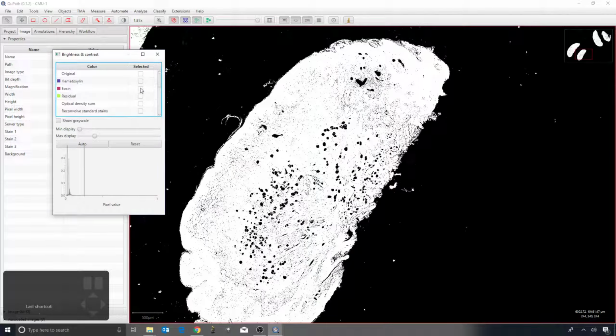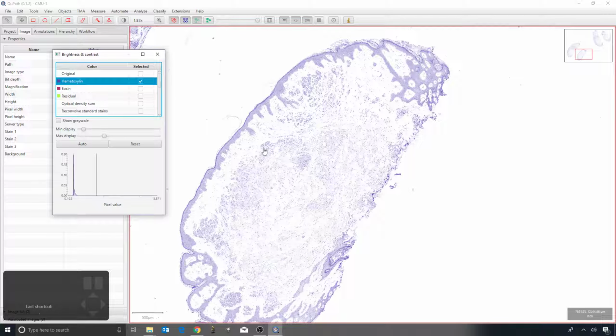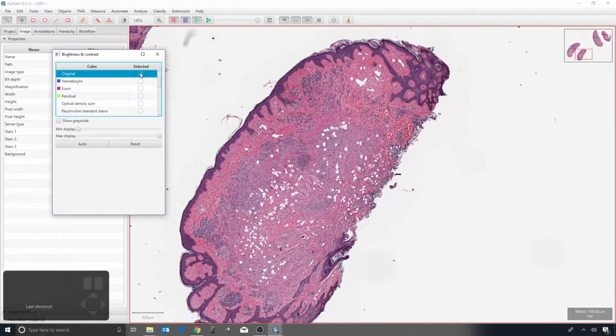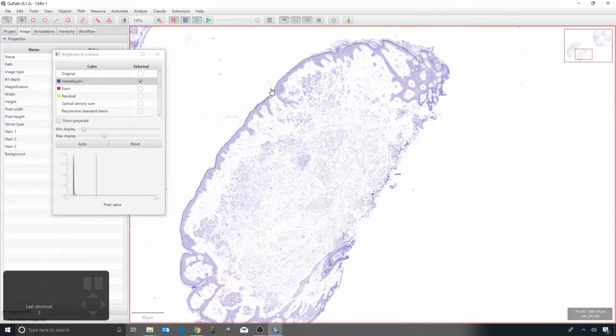But we can make these modifications, visualize the color transforms, and then this will also impact upon the pixel values that we see in the bottom right hand corner of the image. And so the stain separation is using the standard kind of color deconvolution approach. And this then helps explain why whenever I type a number, it will digitally separate the stains. If I press 2, 3, so on, it's basically going through the list of these available color transforms.